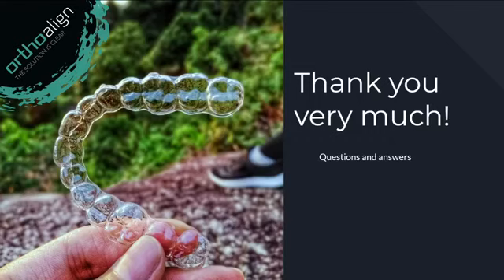If he only has a stone model and an RX form to work on, he will not be able to give you a single accurate assessment of the orthodontic possibilities for that patient, because our orthodontist does not know what's going on underneath, and there are no patient photos to really see exactly what can possibly be done.